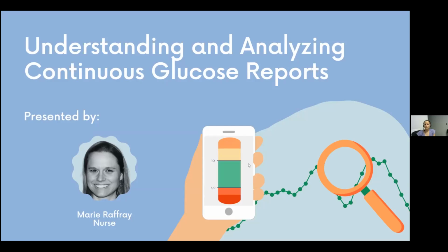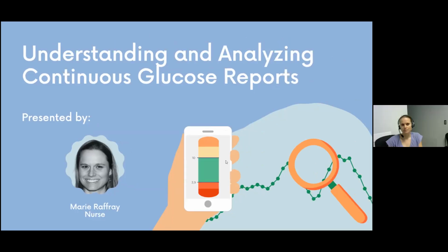So my name is Marie Raffray. I'm a nurse at IRCM, Institut de Recherche Clinique de Montréal. I work on Dr. Rabassa-Lore's team in type 1 diabetes. And today we're going to look at continuous glucose monitoring.